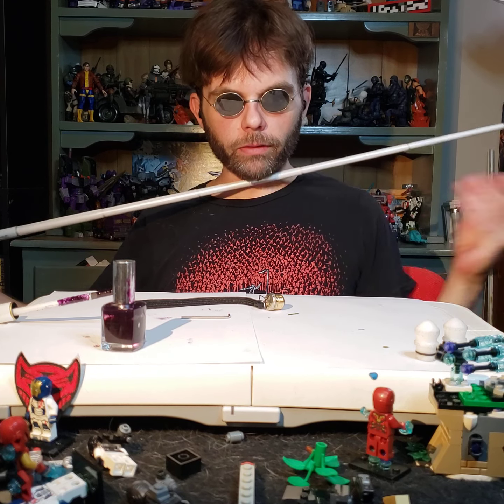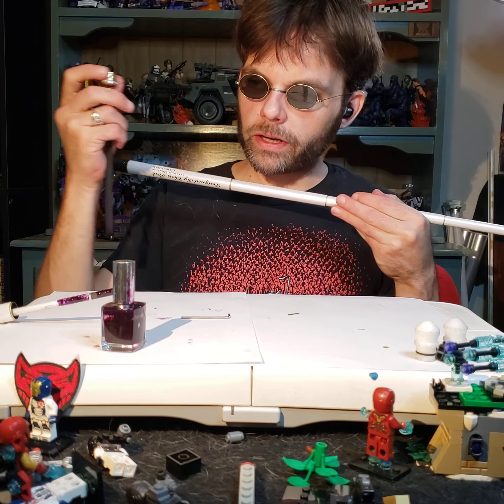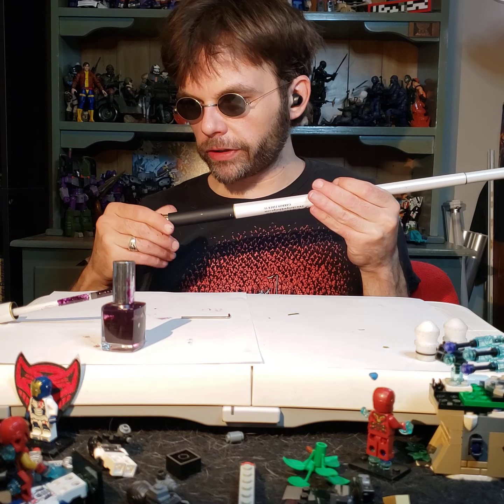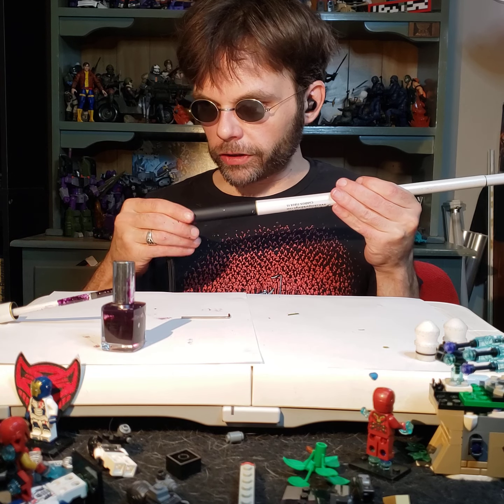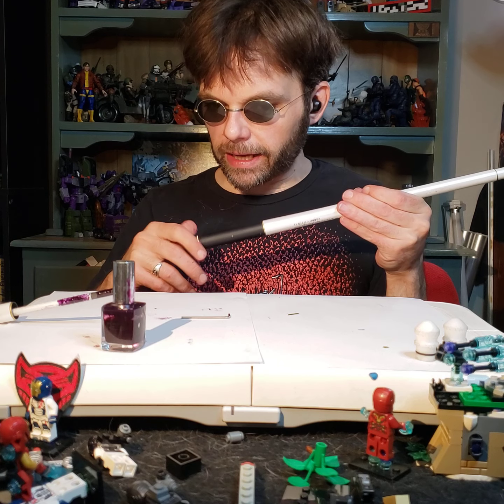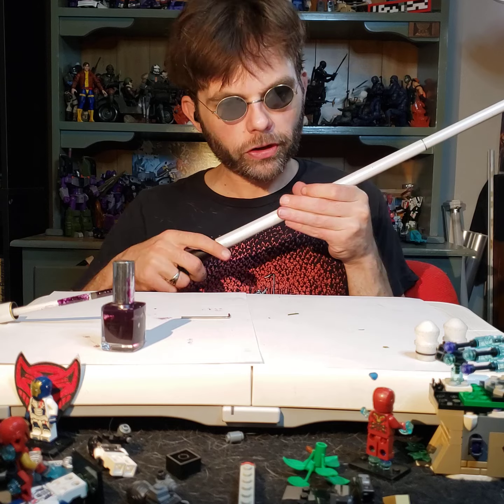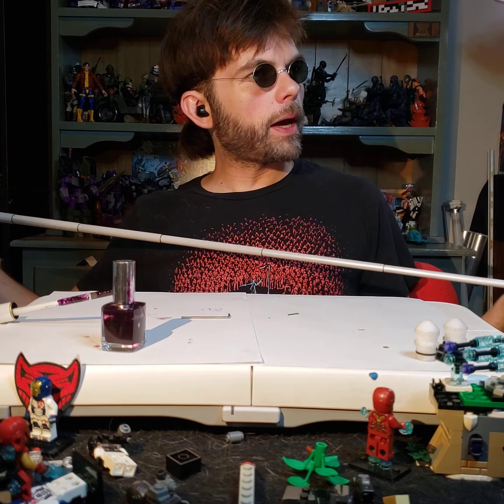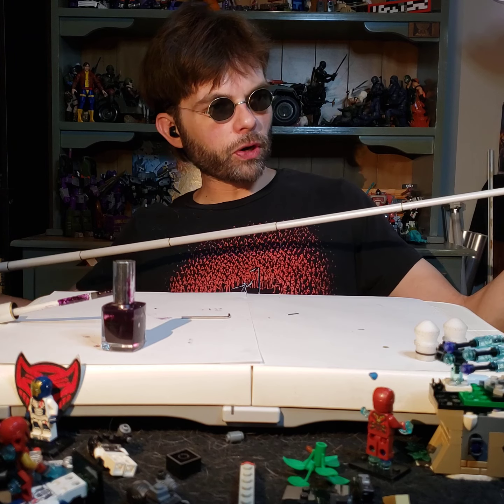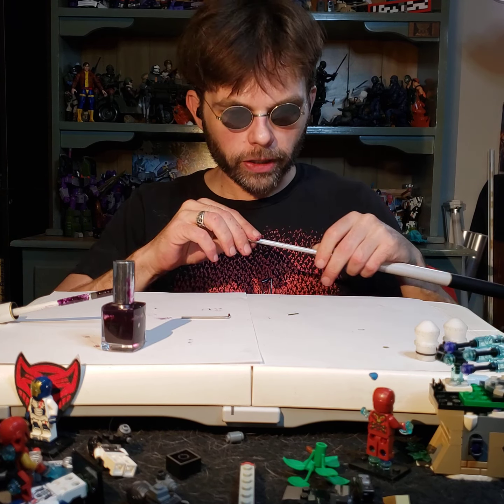So while we've got it extended, where's my cap for it? Here's the cap. Let's put the cap back on the end. Usually these caps are silver. I actually don't know what color this one is. It was the ILA, Independent Living Association carbon fiber canes that I originally used, that I got from my brother. And I upgraded to designer Chris Park Designs. All right, let's collapse them on down so we have an easier work area.